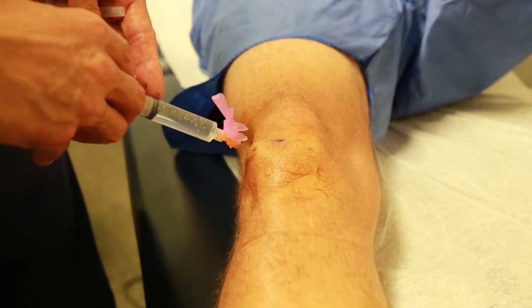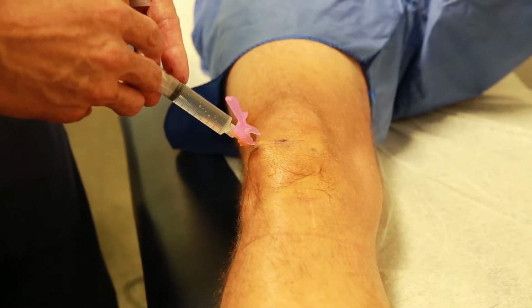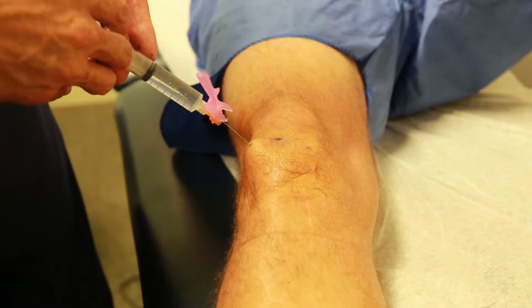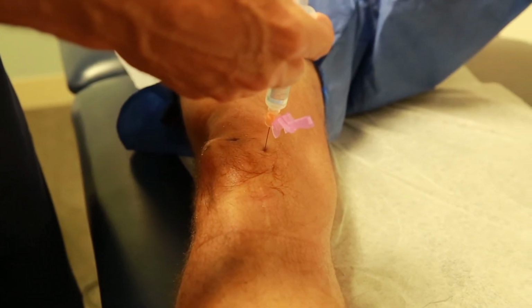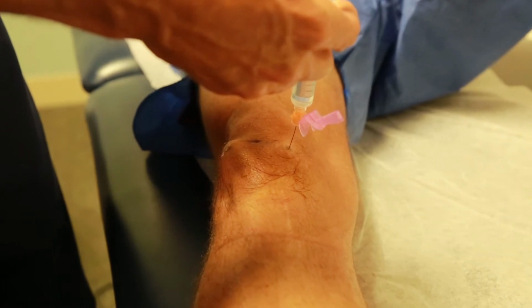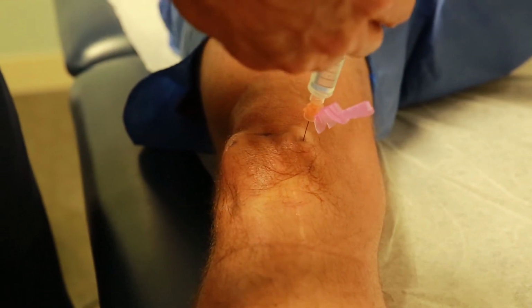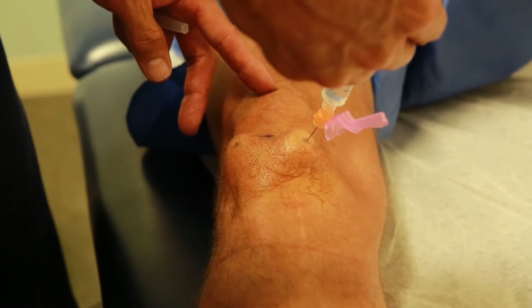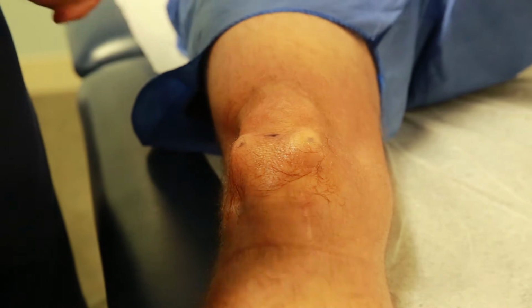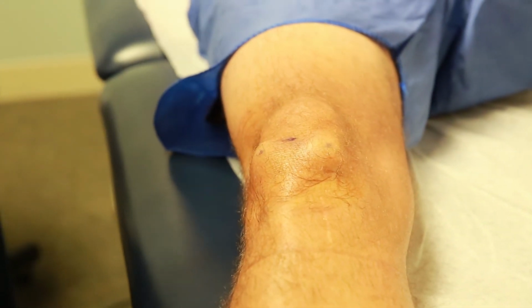Now, some doctors like to use this needle to sound in the joint so they can figure out where they are, and that's fine. I'll often go to this side as well, and it's that initial stick that hurts and burns. I'll put a little bit in the fat pad, but not a lot in the joint. If you put too much in the joint, then you're going to have difficulty seeing. And then we just relax.